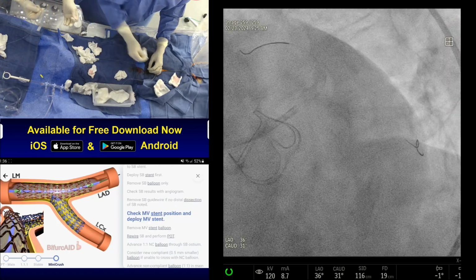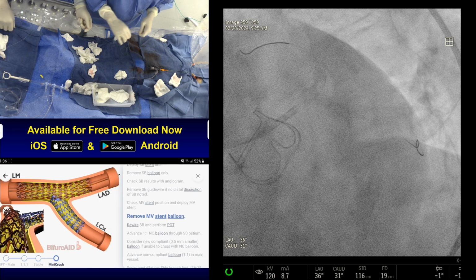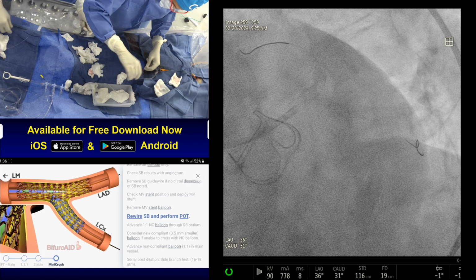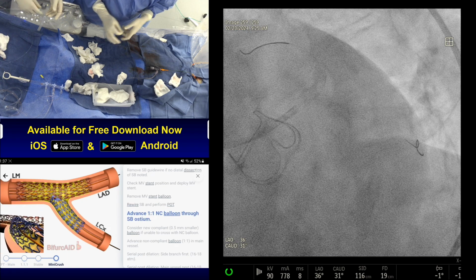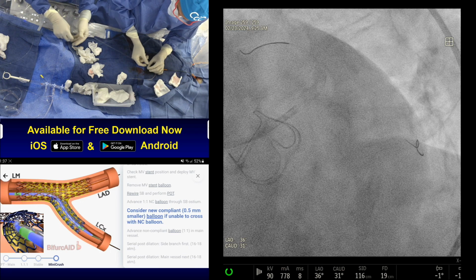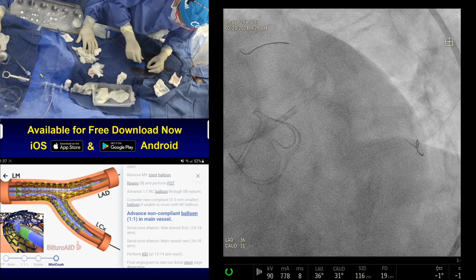What we would say, just avoid the first cell in your mini crush. Because then you'll not be able to open the ostium properly. But otherwise it goes to the mid portion, little distal. I think it's all theoretical. First, second cell is the one that will be maybe a little troublesome because then same. The ostium, because of the lack of the stent material, will not open nicely.